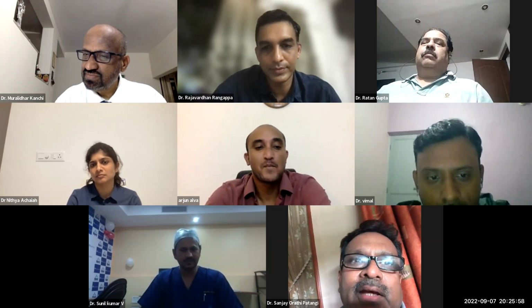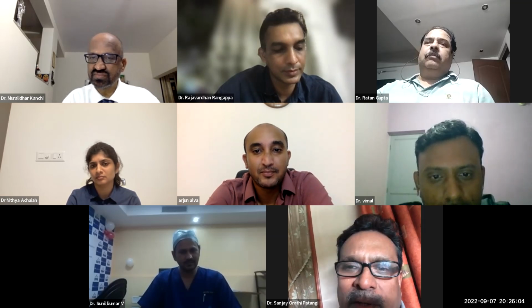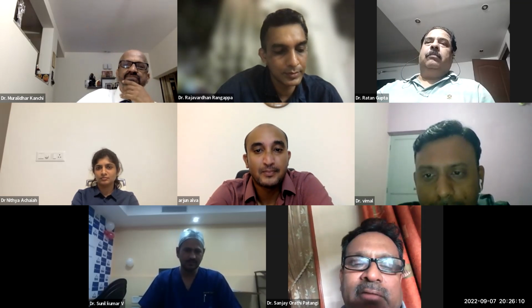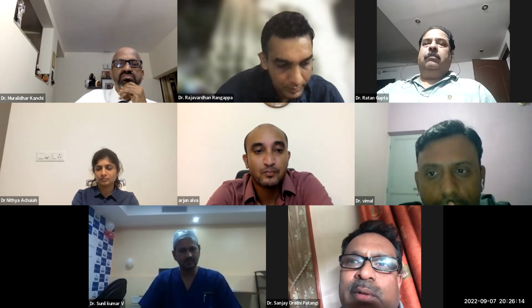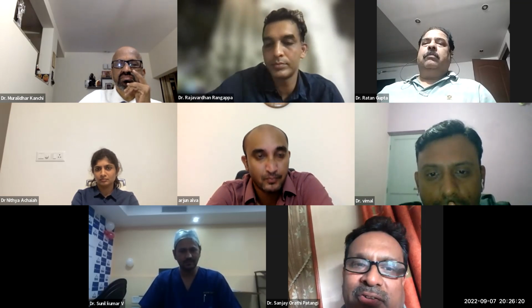Now, if you had a patient like what Sunil had depicted in his talk, where he had a complete whiteout of a lung, which was a combination of both a reperfusion injury as well as bleeding from the parenchyma into the main airways, in a situation like this that would warrant a lot of bronchoscopy and toileting and hoovering out of the tracheobronchial tree.